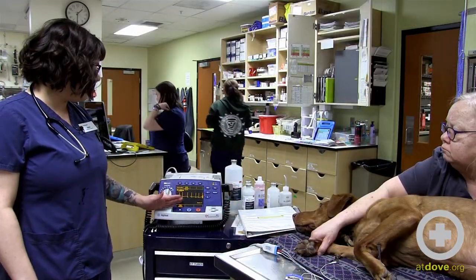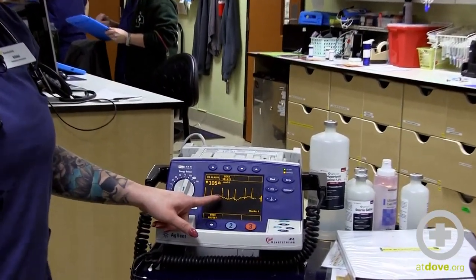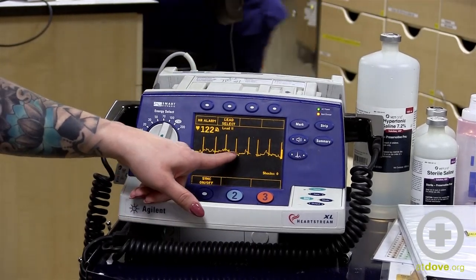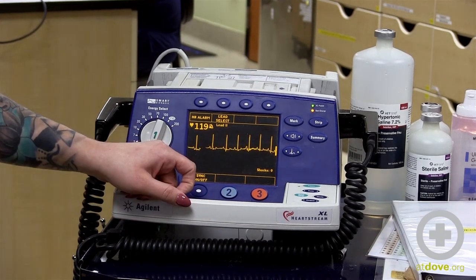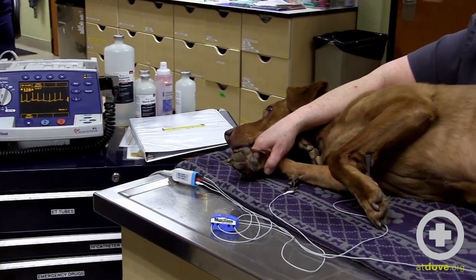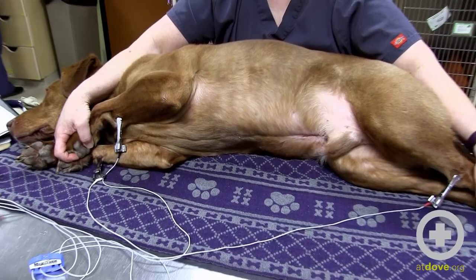We can see that it's reading pretty well now. I can see P waves with QRS complexes and I'm pretty happy with what my leads are looking like. Some things you can see as artifact — whenever he moves, I start losing the clear association of P waves with QRS complexes and the spaces in between those beats. Things that can cause artifact are patient movement; his leg dangling can actually cause some artifact. So if I'm not happy with how clear my image is, I could have both front limbs restrained. But he's doing really well and it's reading well for me. And that's how we place ECG leads here at Dove Lewis.